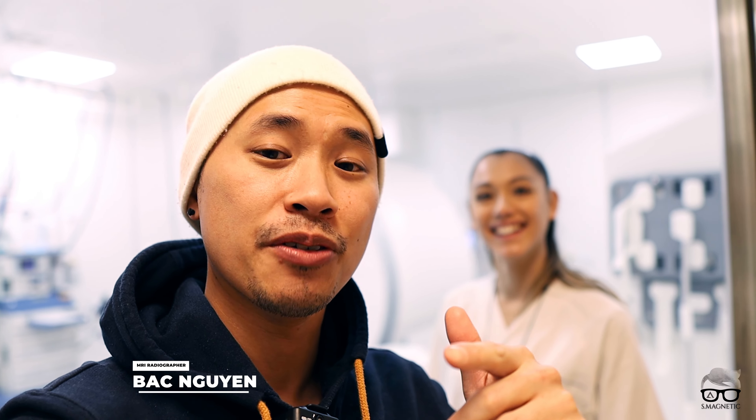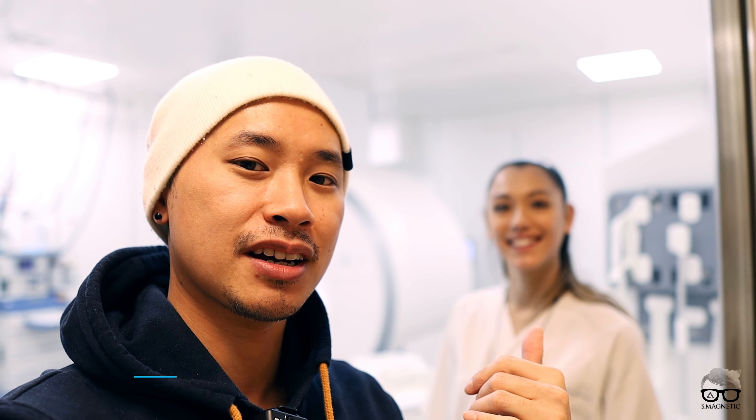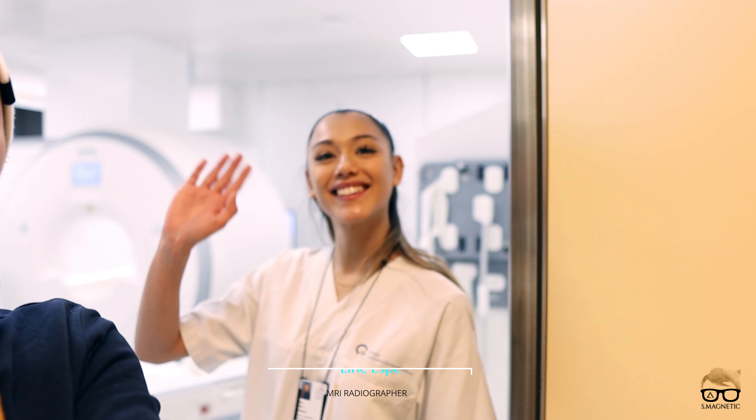Good morning! Welcome back for another video. Today I'm going to show you something pretty awesome which can be more efficient and help you work faster. I have a colleague with me today — it's Lina, and she's going to be my demonstration subject.